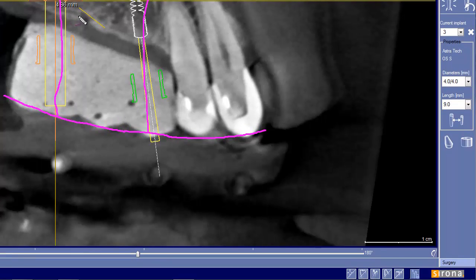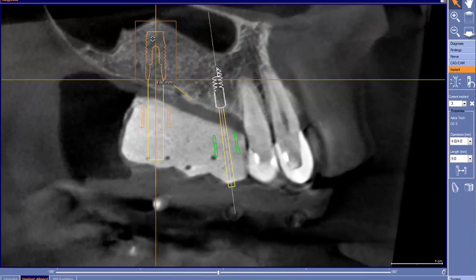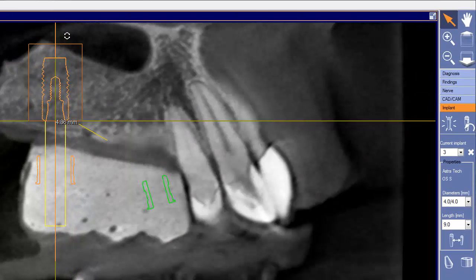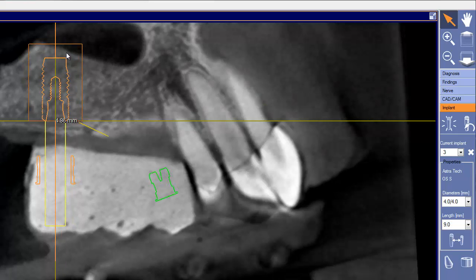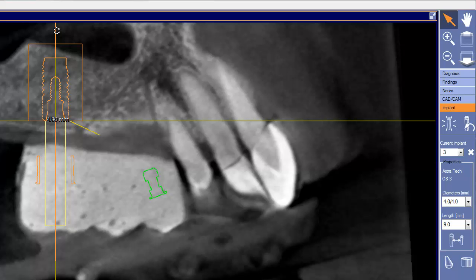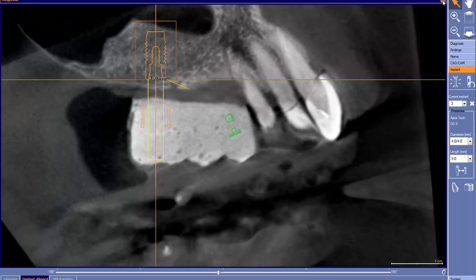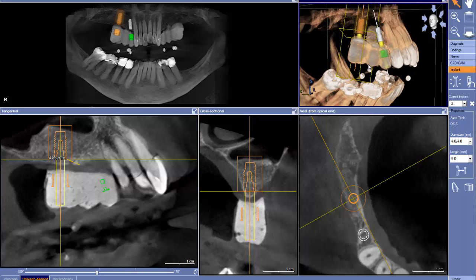But in this particular case, what I'm seeing is that these teeth are crooked, pointed down. So ideally, if we went something like this, now we can see how we're suddenly starting to get our forces more along the long axis of our restoration. As we can see in this view right here, our forces are more along the long axis of this tooth.